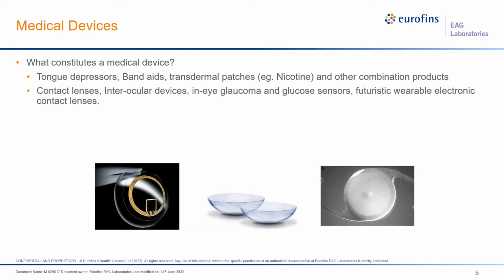Materials such as contact lenses, intraocular lenses, and advanced contact lenses such as in-eye glaucoma and glucose sensors, and a whole lot more also constitute medical devices. Certainly, in the near future, we may even have contact lenses that have built-in TV or computer screen, and these are very complex devices.